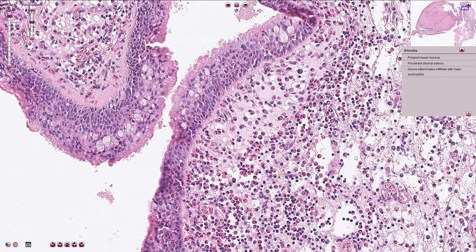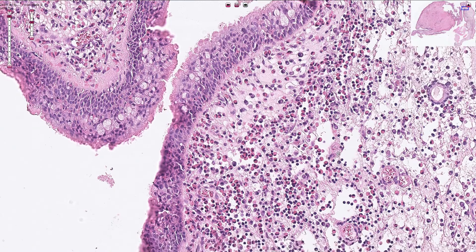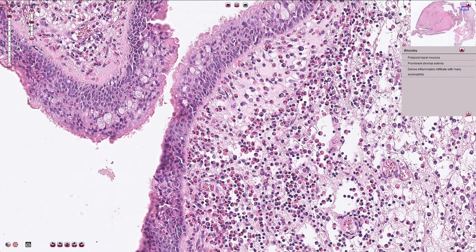Here we have lymphocytes and plasma cells, but most commonly we usually see a lot of eosinophils. Those are these cells with eosinophilic granules inside of the cytoplasm.